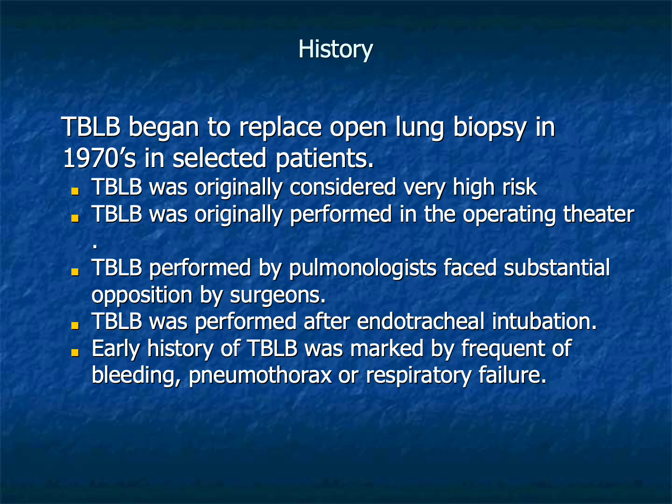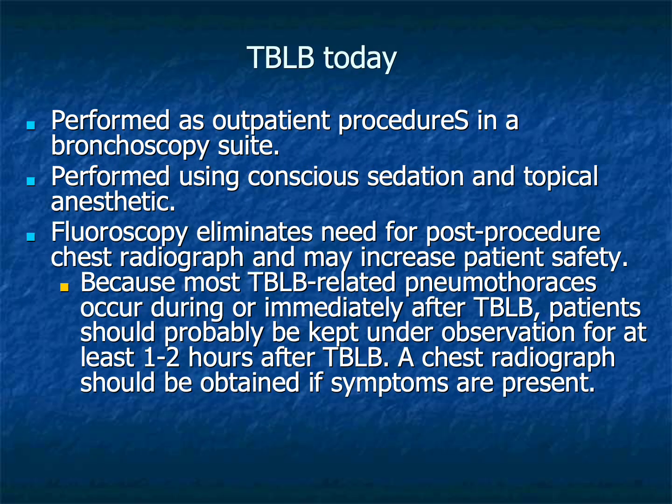Early experience was associated with relatively frequent bleeding, pneumothorax, and respiratory failure. As technology improved and operator experience increased, the procedure gradually became accepted as a routine component of interventional pulmonary practice.